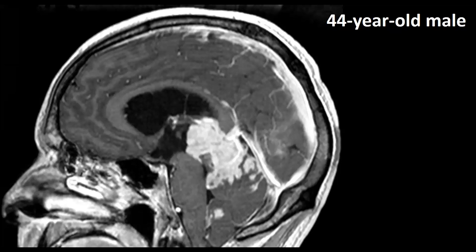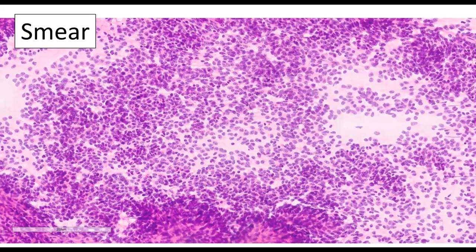All right, so here we'll look at the sagittal, almost mid-sagittal section. You see the cerebral aqueduct. All right, let's look at the path. Here's the cytologic smear. If you gestalt it, and then look closely, look at these rosettes. A few of these rosettes, even on the smear, I've highlighted, because it's really hard to see them at this magnification. This was 40. We really needed a 60 high dry, which the cytopathologists use all the time. We don't have them. People tend to steal those objectives. They're very expensive. You just unscrew it. Anyway, story for another time.